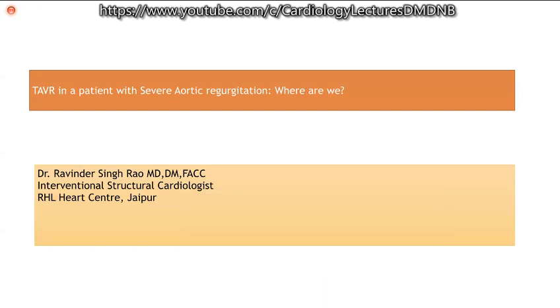Can he hear me? I just wanted to ask him a question in one of his cases where he put in a 32 valve with 3 cc's extra. Yeah. Hi, Dr. Segitis. We haven't met, but nice to see you. So the case with large annulus, which you did by adding 3 cc's extra to the 32 millimeter valve. First of all, congratulations for pulling off those complex cases. Did you notice anything abnormal with the leaflets on a follow-up echocardiogram of that patient where you added extra 3 cc's in a 32 millimeter valve?